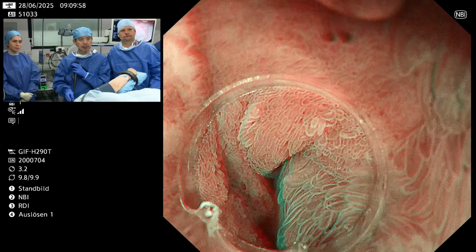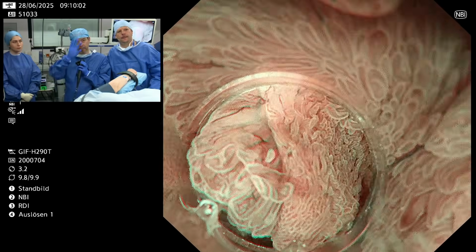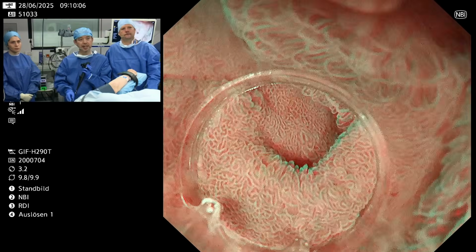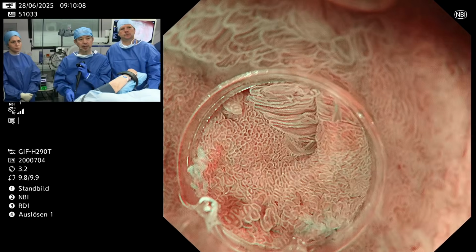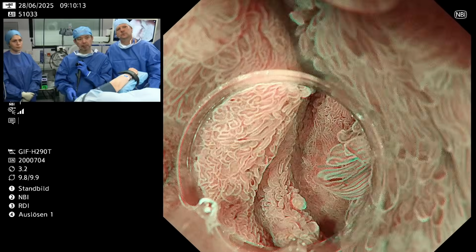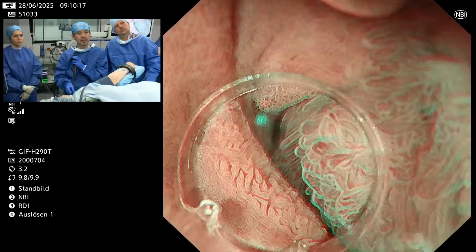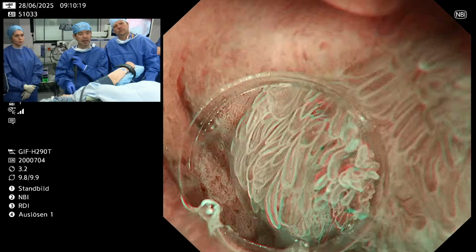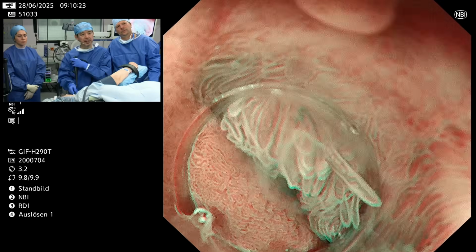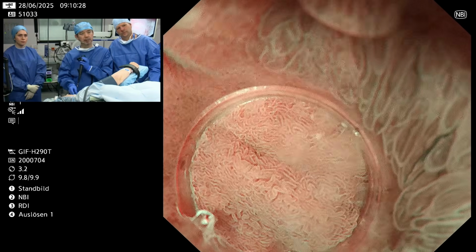And this is a relatively tricky lesion because the upper part is relatively big, which is 3 centimeters in size, but the stalk is really short, semi-pedunculated. So going behind this lesion is a little bit difficult. I have to start my procedure from the back side in order to make sure the endpoint of the submucosal dissection.